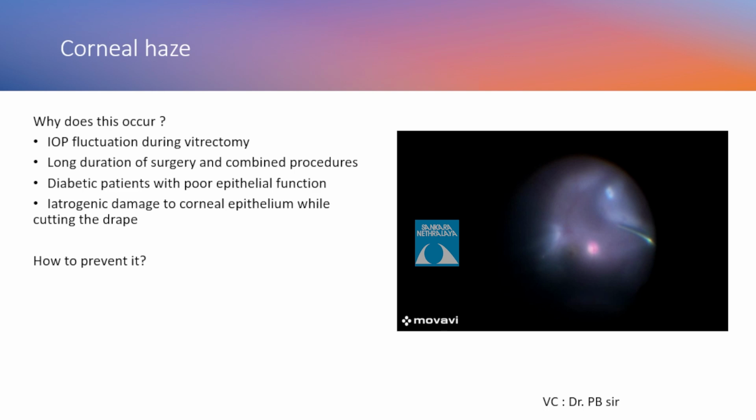Ideally is to use sodium hyaluronate as a wetting agent, but it's very expensive and we can't afford to use it in every case. We are using methyl cellulose, but methyl cellulose is not the best wetting agent, but unfortunately we are forced to use it. Okay, but if you can afford it, use sodium hyaluronate. That's pretty good. Next one.